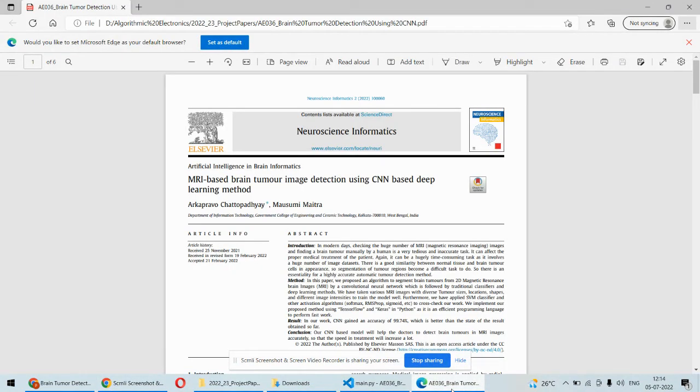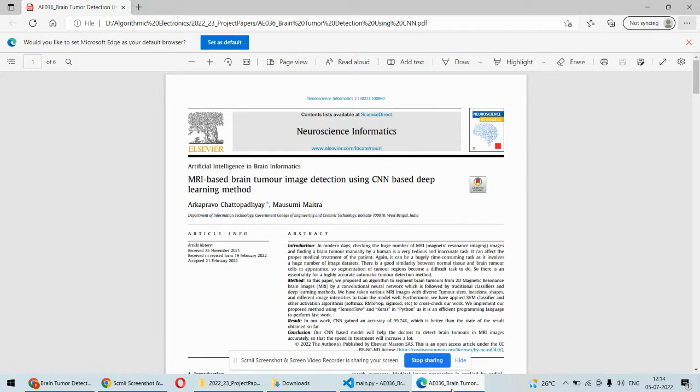Hello and welcome to our YouTube channel. In this video we are going to understand the project or demonstration of MRI based brain tumor detection using CNN or convolutional neural network and deep learning algorithm.